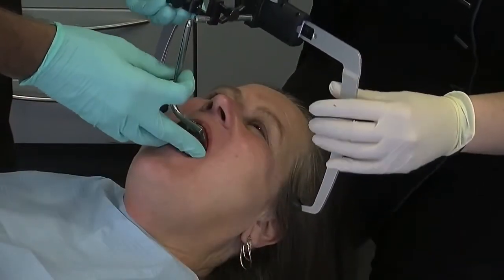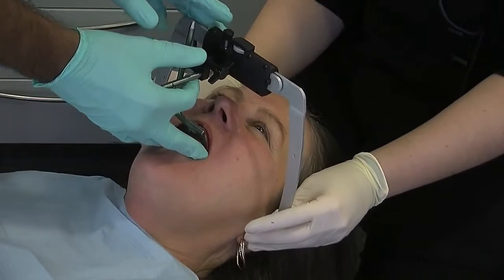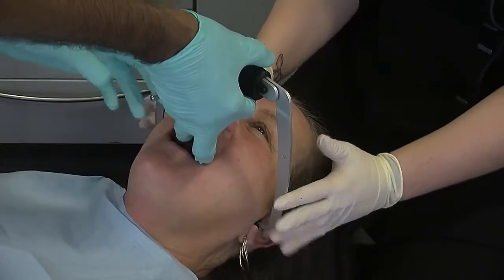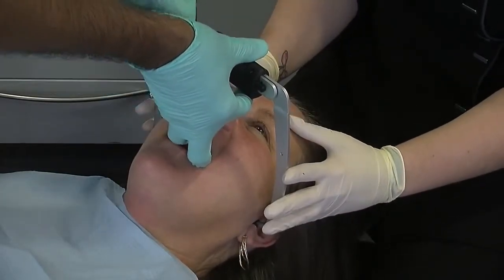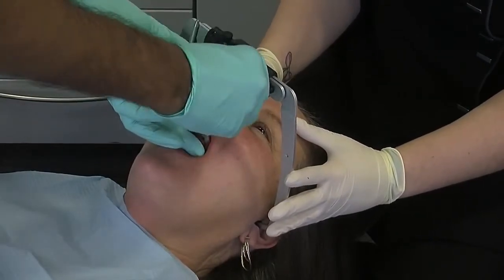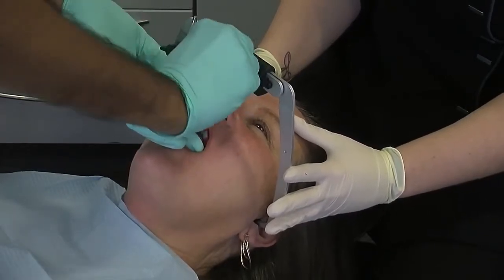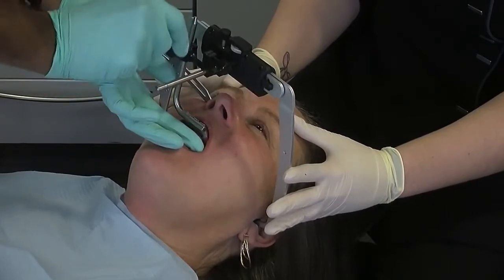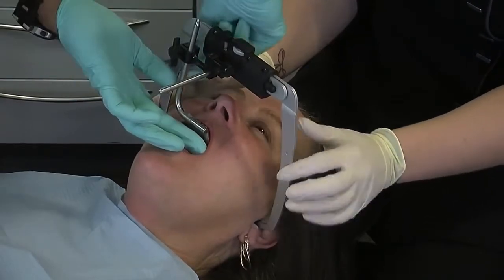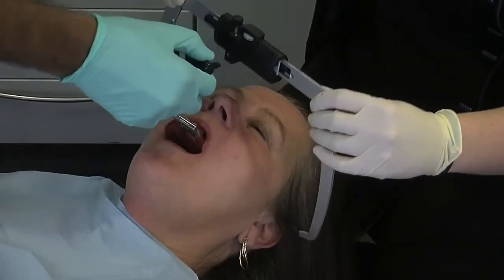We've got the chilled composition back in the mouth. My nurse comes from the back and we'll put the two things in the ears. This just comes like this to the infraorbital notch area. Then I lock number one here, holding this firmly in place upwards. My nurse is holding the things in the ears properly. You lock number one, and then you lock number two. Make sure it's nice and tight. Put this back in, undo this a little bit, move this out of the way — and that's the facebow record done.